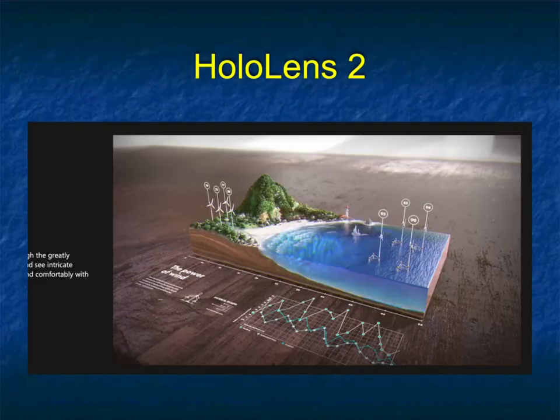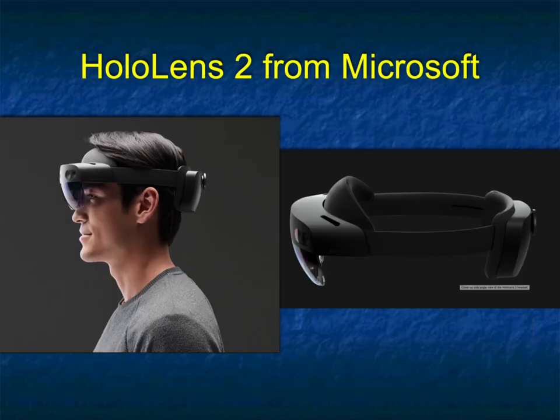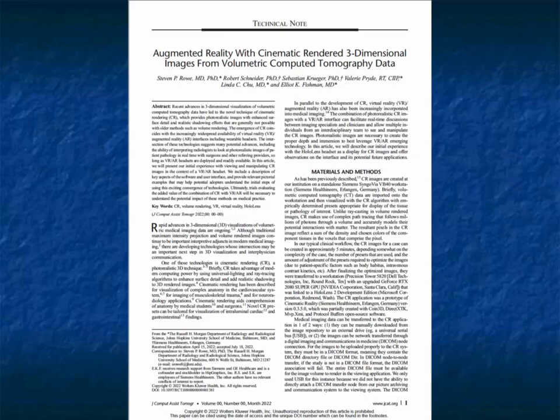And in this last part, we're going to talk about some areas where I think cinematic rendering can be going. One of them is with display. Regardless of the fact that it's 3D imaging, we still look on a display, just like we look at axial images. In the past, we've done some work with different types of displays, wearing different glasses, and the HoloLens is one of those things that's really hot in terms of the fact that HoloLens is being used across a range of different industries to better understand things in 3 dimensions. It gives you the depth and it gives you the ability to interact with the data using hand gestures.